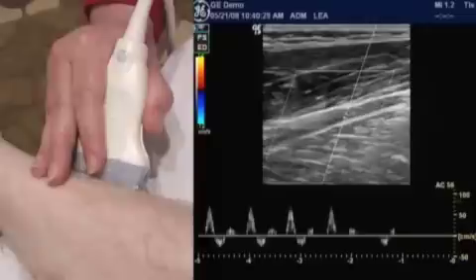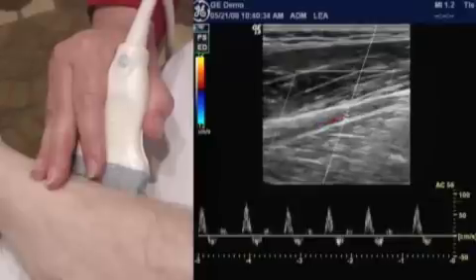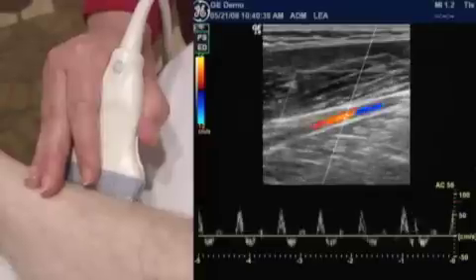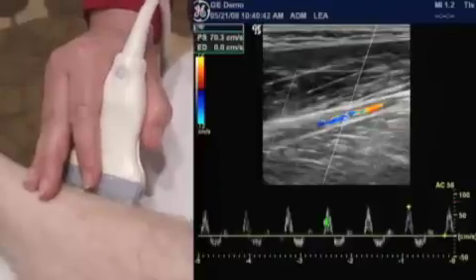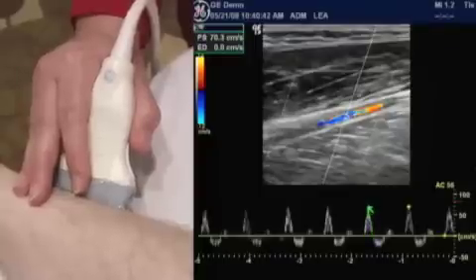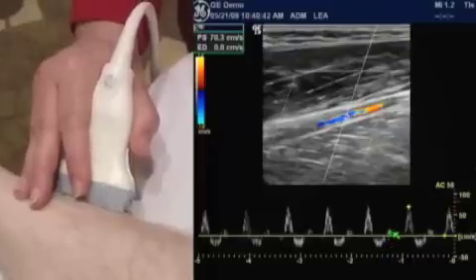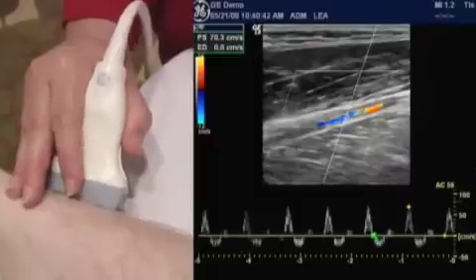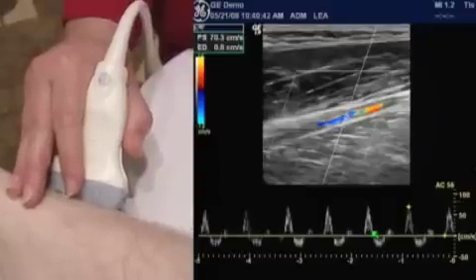There's that Doppler. If we don't see that multiphasic Doppler, then we have to think either we're dealing with somebody who is in a hyperemic state, or perhaps they have an occlusion. It all depends on what's going on in this portion of the waveform. If we basically only see one systolic component, just this bit right here, and no reflected wave and no antegrade component at the end, we're probably dealing with a patient who we're upstream from an occlusion. It's experiencing pretty significant resistance.